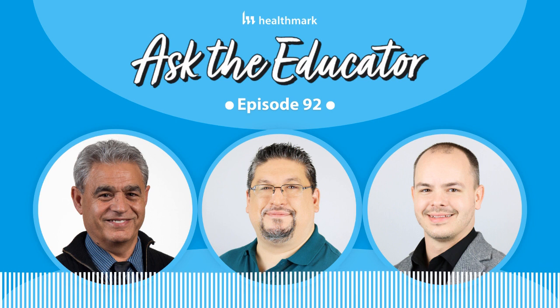So there is an issue with being able to make sure that the conductivity of those cords is intact. Yeah, and that should get people's attention right away. If we're talking about surgical fires and burns to the patient, these are serious things that sterile processing really needs to care about. And typically, when we talk about insulation testing, most people think laparoscopics. Oh yeah, I test my laparoscopics for insulation. That's not the only thing you should be testing. If we look at Amendment 2 from ST79, it does say cords, and not only insulation testing of cords, but conductivity. We need to make sure the cords are actually working the way they're supposed to work.